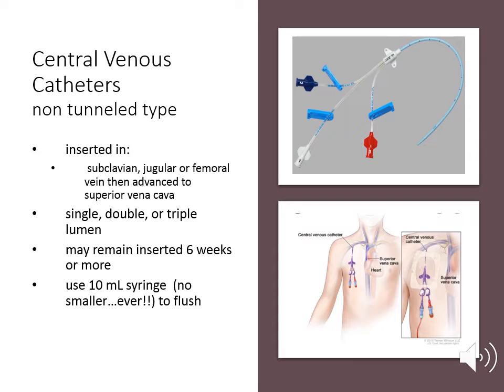You want to make sure that transparent dressings are usually changed once a week, PRN as needed, and every 2 days for a gauze dressing, but it's very unusual to use or see a gauze dressing. Most facilities will have some type of dressing change day when it comes to central lines. So I know Ellis, they like to change their dressings on Wednesdays. So if somebody has a central venous catheter, you would change their dressing on Wednesday or PRN as needed if it's sooner than that.